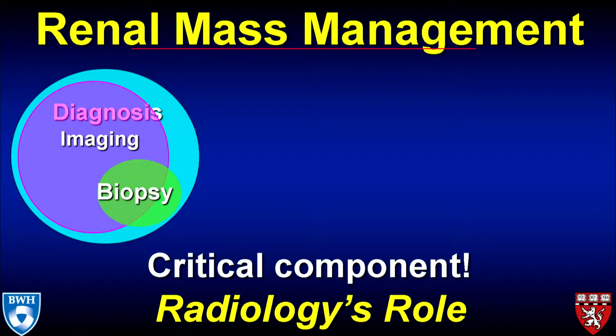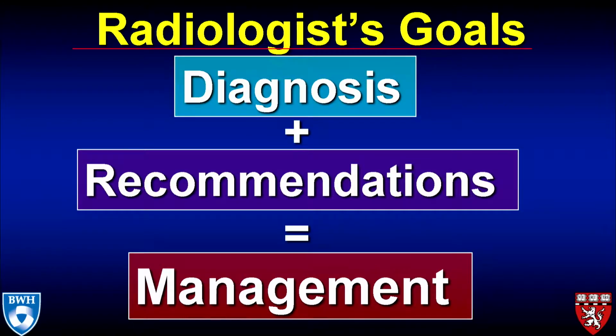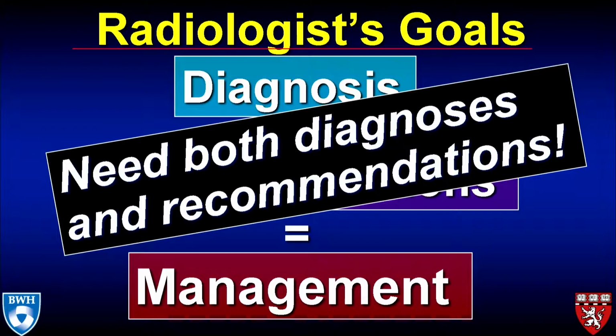So what is the problem with the diagnosis and treatment of patients with small renal masses? Well, it turns out it's a radiology problem, and I'm going to try to suggest to you how we are trying to fix it. So, of course, our goal is to diagnose and make appropriate recommendations, and I urge you to include recommendations in your reports.